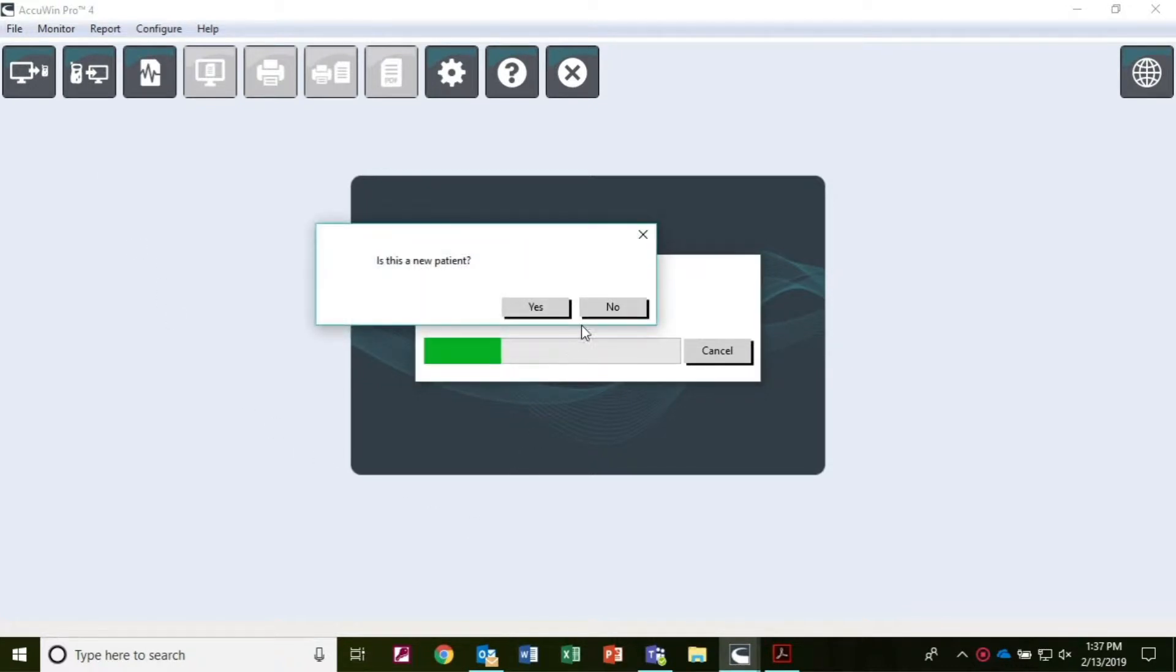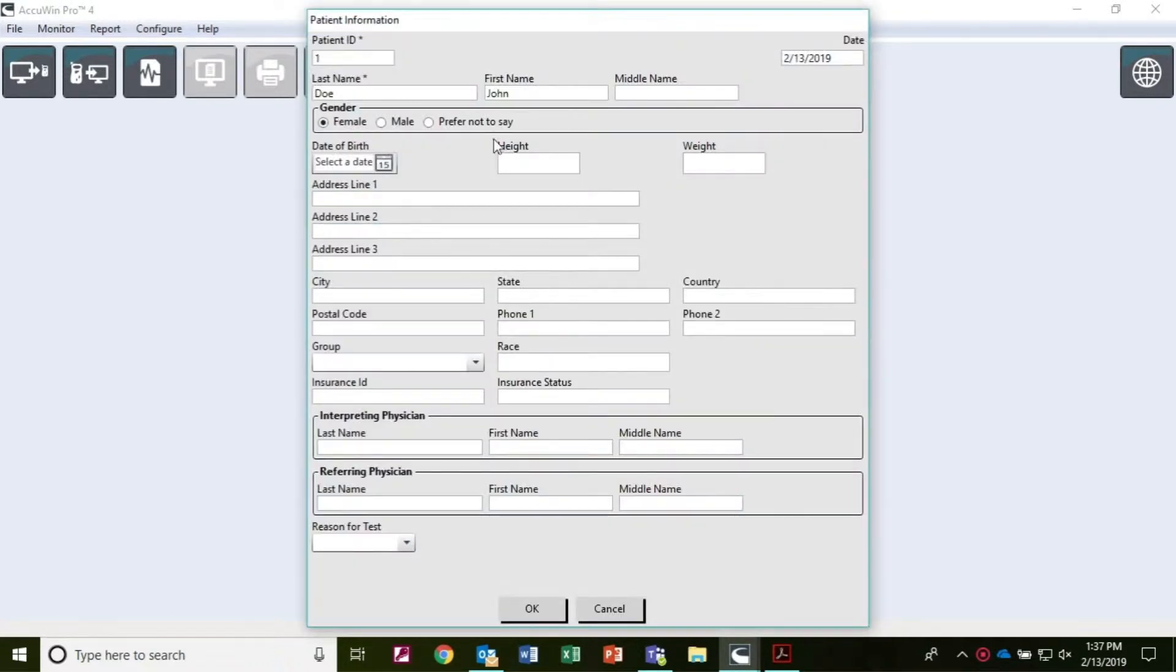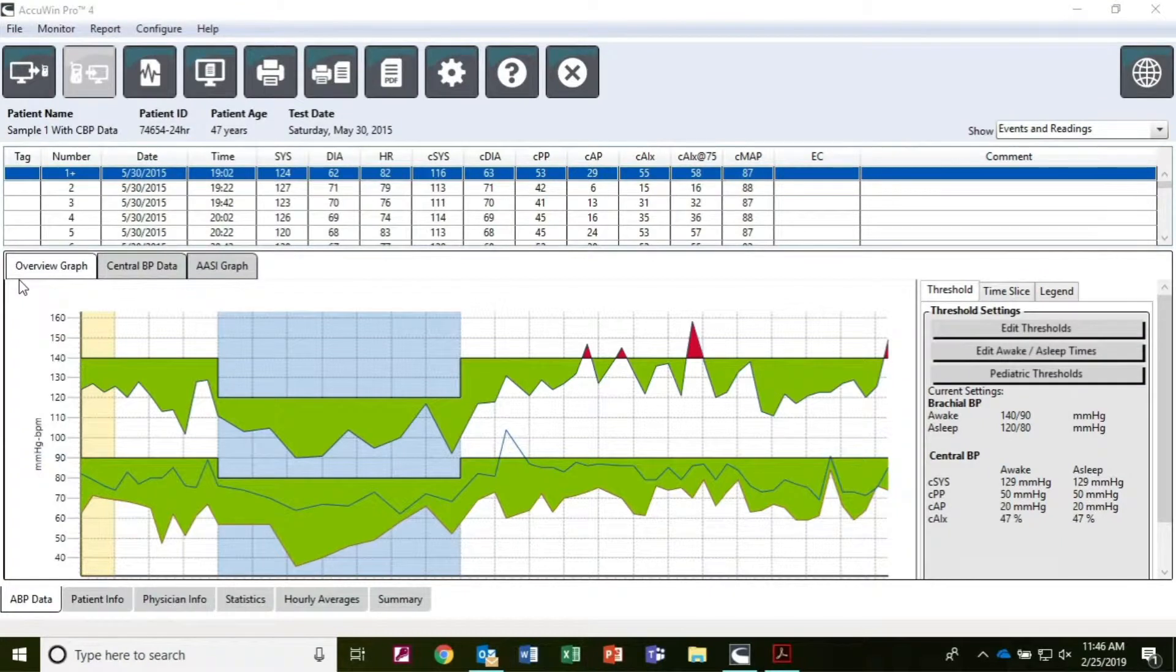Select whether the patient is a new or an existing patient. Fill out any further patient information as required.